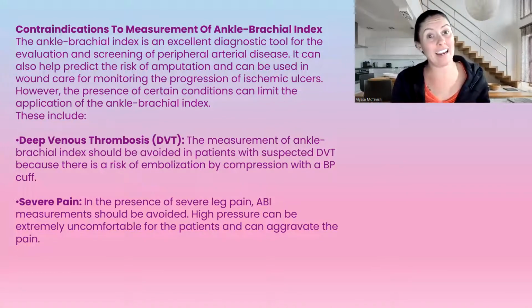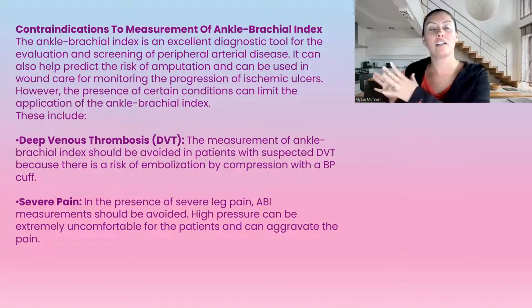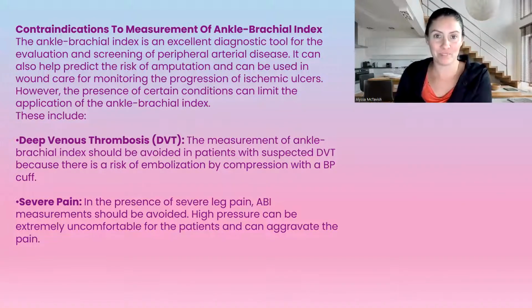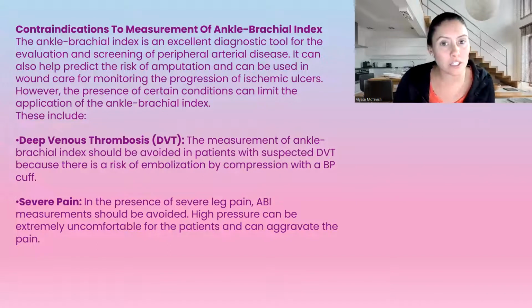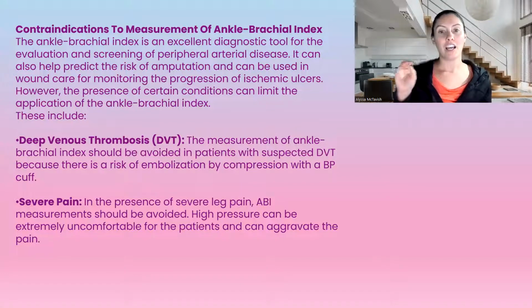And I also want to add in on this, if somebody has a stent put in to their legs before, or if they've had surgery on their legs, on their veins, on their arteries before, do not compress the legs. Okay, we do not want to be doing this. We do not want to dislodge anything. We do not want to dislodge a clot, okay, because this will cause an embolism. We do not want this.